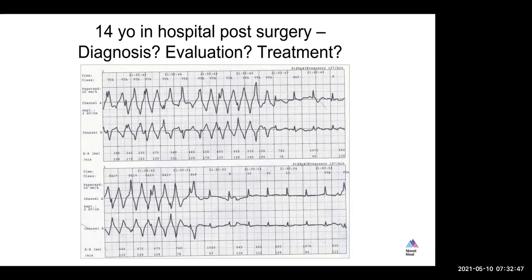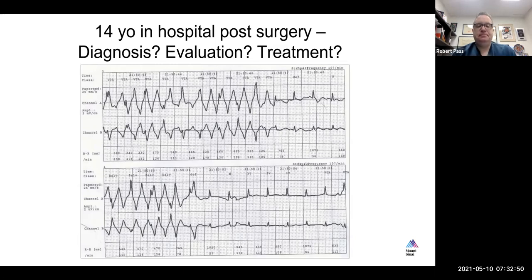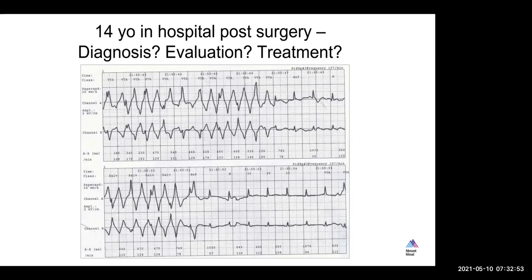Morning, Dr. Parth. Morning, Zoma. So looking at this, the first part of the strip shows the QRS appears to be widened. And then towards the last third, the QRS narrows down. And in the second strip, I see some deflections that appear to be P waves. So that may be sinus. Going back to the first half, the rate seems to be about 150, a little higher than 150, so maybe like 170. And then it continues.